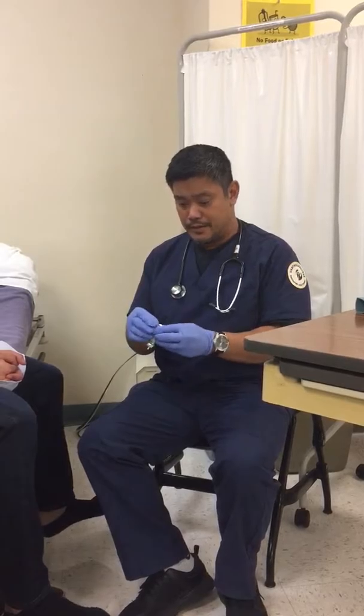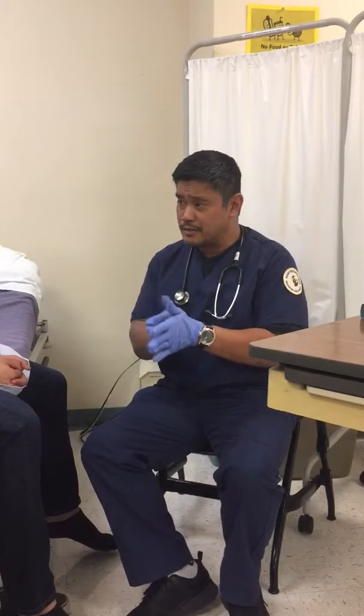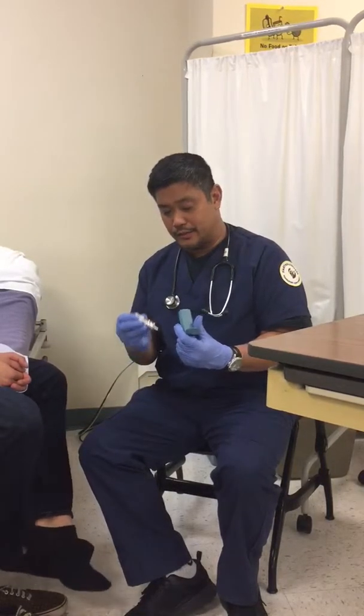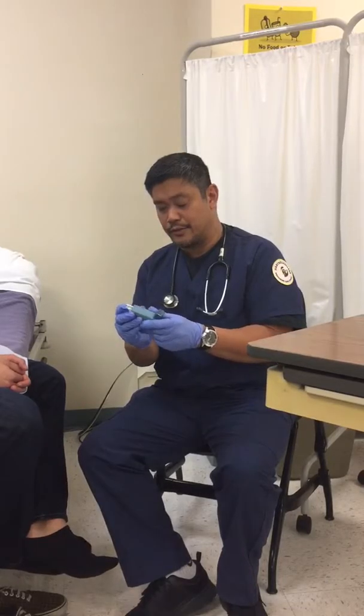For a brand new device, or if it's been stored for a while, we want you to go ahead and warm this up. It'll allow the medication to flow better. Just between your hands, go ahead and rub it a few times between your palms. Once you've done that, go ahead and insert it into the inhaler itself, and there's a little port right over there, and go ahead and insert it on the inside.